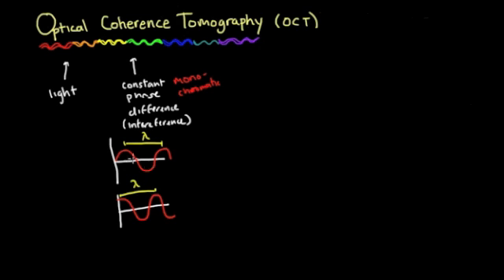This, you would imagine, might look the same as this if we just shifted it over to the left. And so this horizontal difference in the peak position, this shift here, move this over to here, that is called the phase difference. When things are in phase, the peaks align with one another. So if this peak matched up with this peak, we would say it's in phase. When the peak matches up with the valley of the other wave, that's called out of phase.